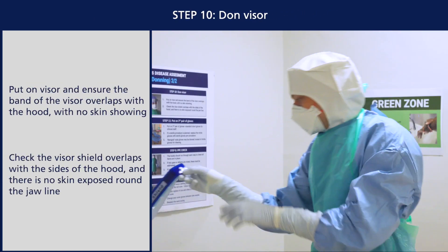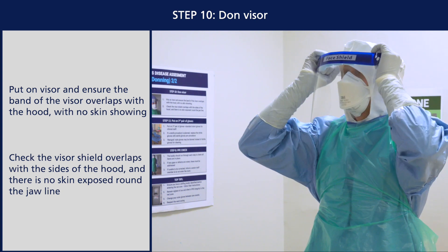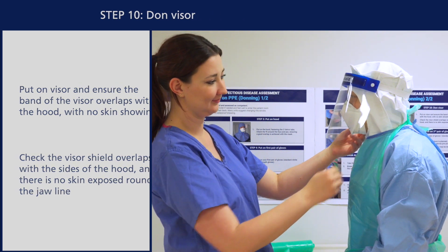Put on your visor and ensure the band of the visor overlaps with the hood with no skin showing. Check that the visor shield overlaps with the sides of the hood and there is no skin exposed around the jawline.